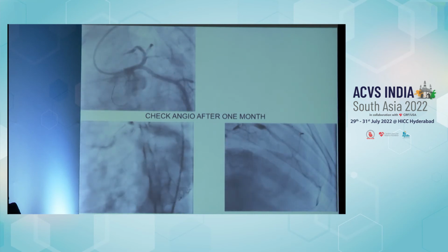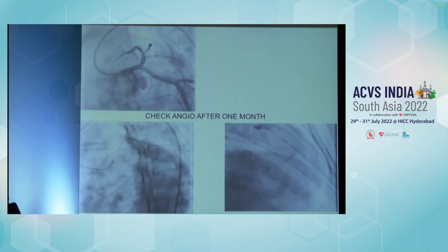There's a small coronary aneurysm there, and there's ectasia also there with stagnation of thrombus, which is not going to harm him.